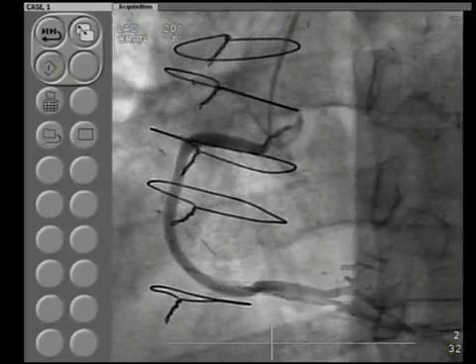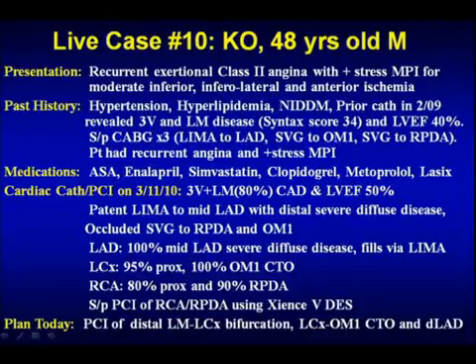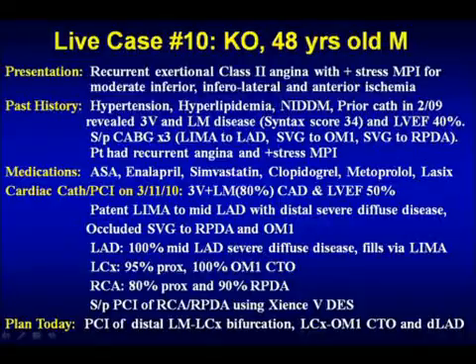That cath at this time showed a 3 vessel and left main, 80%, and EF now slightly better, which is 50+%. The LIMA to the LAD is patent, but distal LAD has a severe diffuse disease. But vein graft to RPD and OM both were occluded now. Then LAD, of course, as I mentioned, has severe disease filled by LIMA. Circumflex has an angulated lesion, which we'll show you, and with a totally occluded OM1, where the bypass went, and there were 2 lesions in the RCA, proximal and PDA.